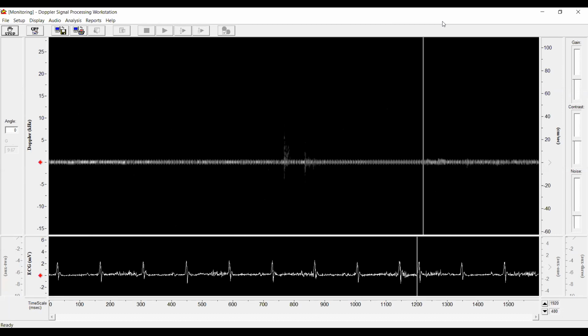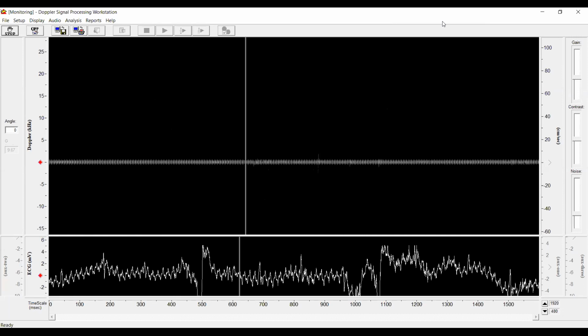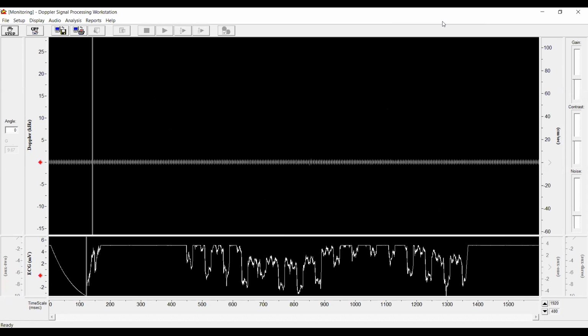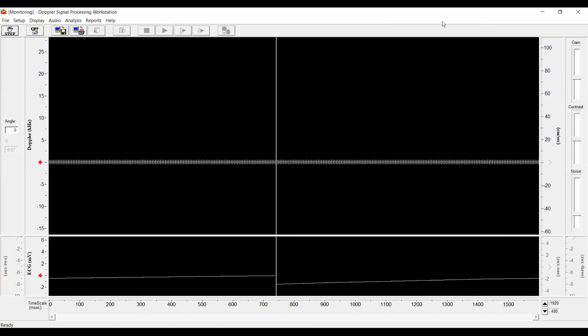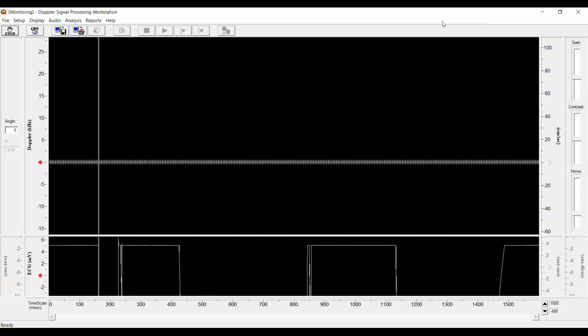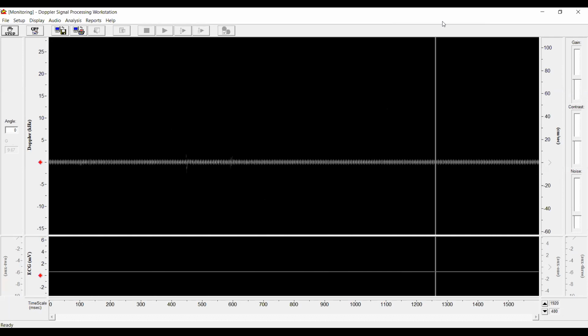But in the interest of the demo, again, we're going to put down another mouse and see. It's a cage mate, so hopefully they have better signals for us. And this is what transpires in a live demo. So sorry, just bear with us.